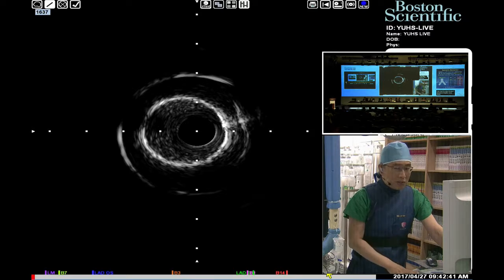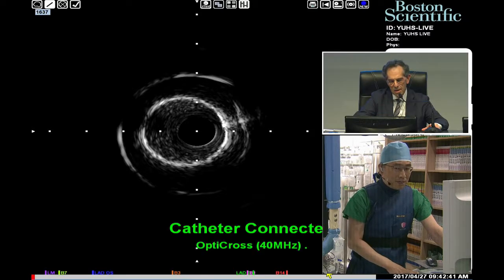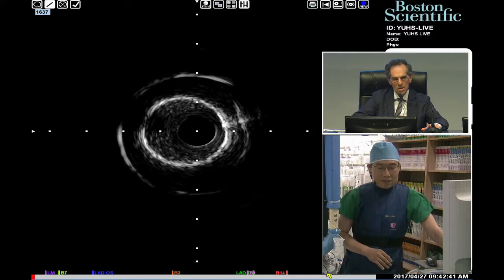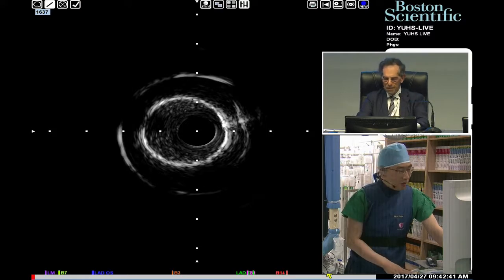May we add something more: in any case you have 2 lesions on the LAD, so they are making the assessment of the left main difficult. The circ is tortuous with a minor lesion there, not very important. So it's not easy to make a single evaluation by FFR. So it seems very reasonable to go by IVUS and make this assessment. Yeah, it's a good point.